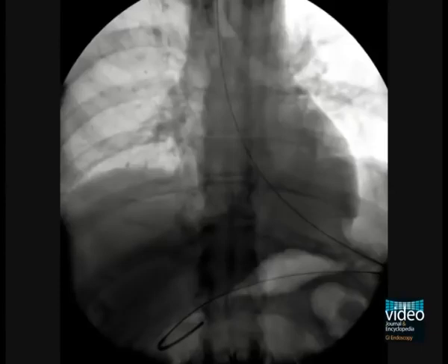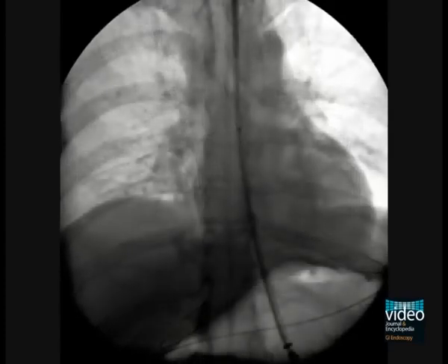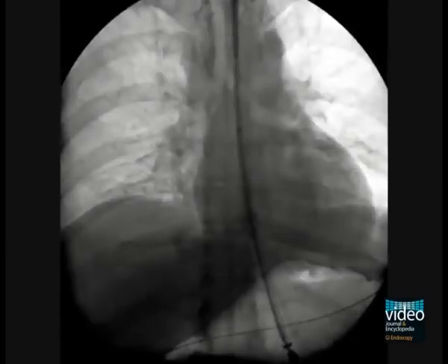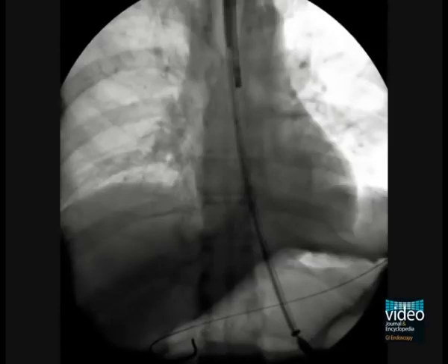A wire — in this case a Savary wire — is advanced through the tumour and into the stomach, and the endoscope is removed over the wire. The stent, in this case a fully covered stent, is advanced across the stricture, with the distal most portion of the stent below the bottom of the tumour.